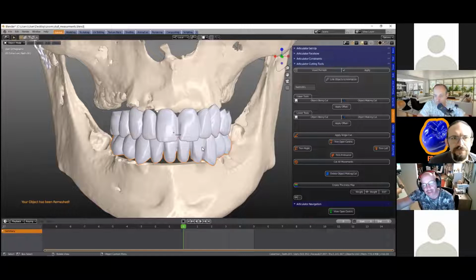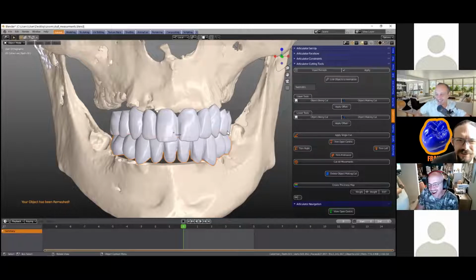Wolfgang, what is your opinion there? Well, it's not affecting the tutorial, so I'm quite happy either way. Okay. Don't make me redo any videos, all right? As I see for the moment, I think we have to do some new videos because the import condyle has changed a little bit, and the Facebow we have to change. But I see that the cutting tools, nothing changed. So if there is no quadriflow remesh, I'm okay with it.